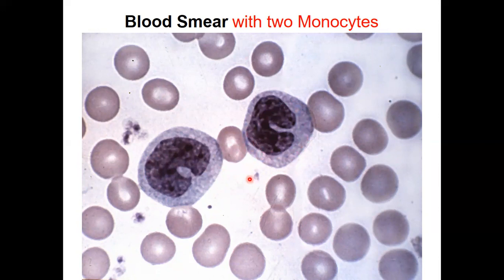So make sure that as you draw these 2 monocytes, draw the surrounding red blood cells as well. Okay. Even some islands of platelets, like this one and that one, and this one should be drawn as well.